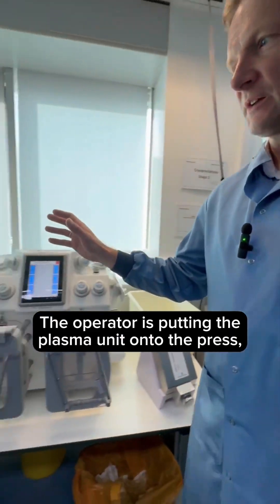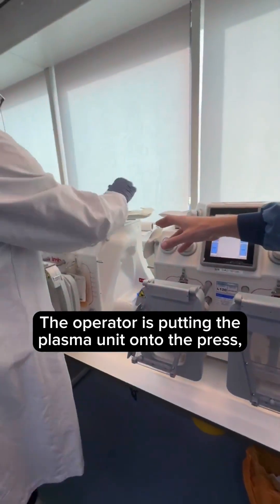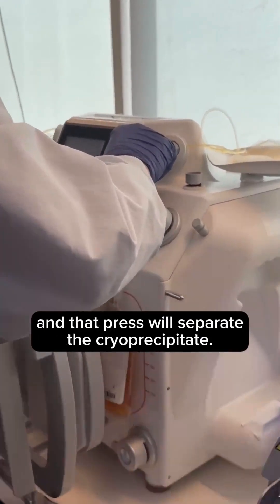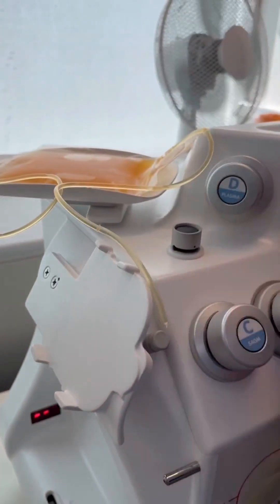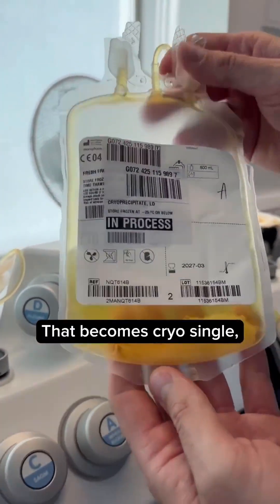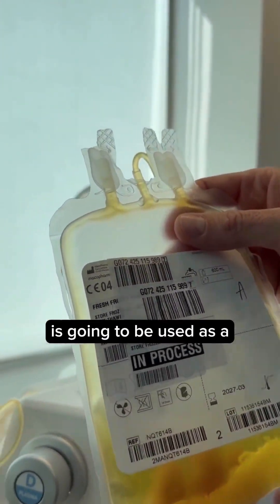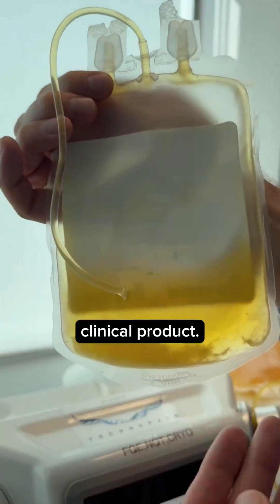The operator is putting the plasma unit onto the press, and that press will separate the cryoprecipitate. That becomes cryo-single with the clotting factors, and only about 50 mils of that is going to be used as a clinical product.